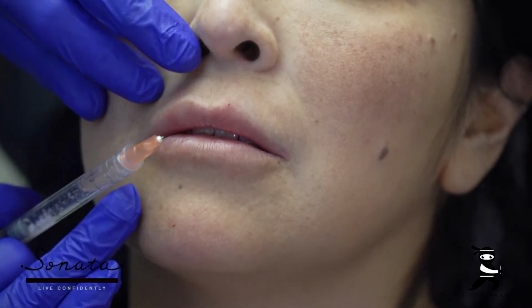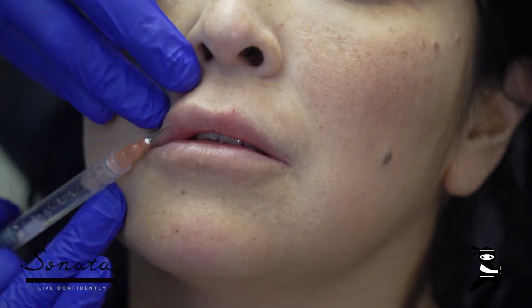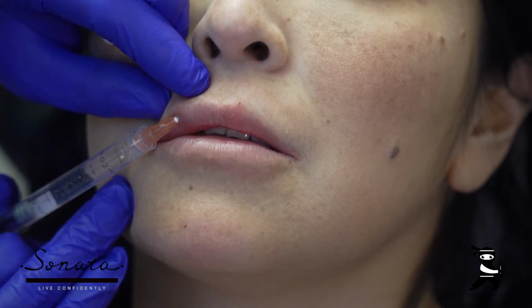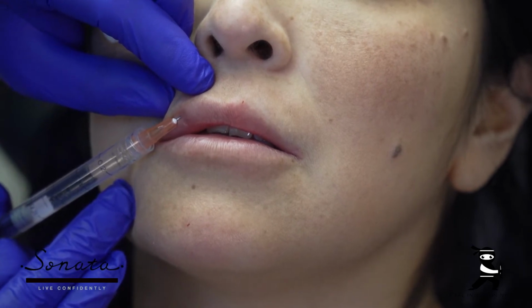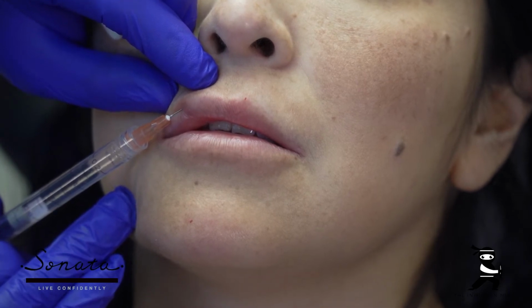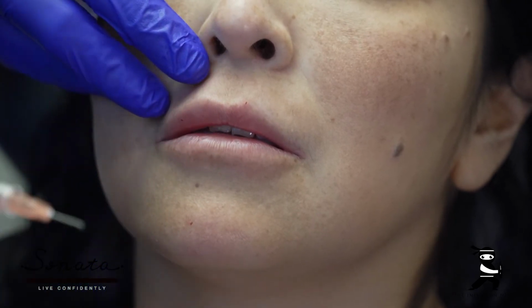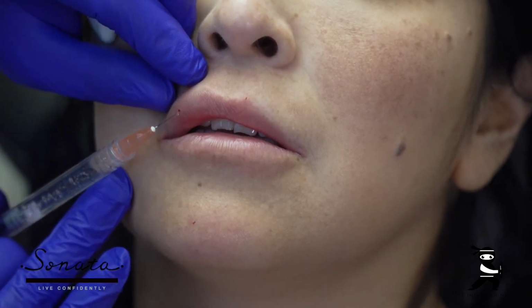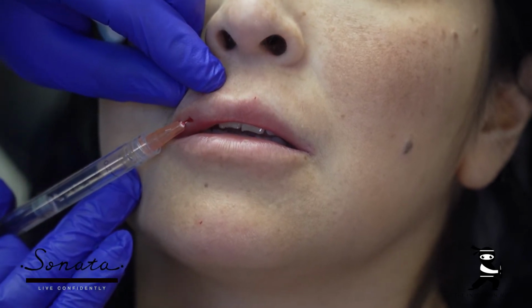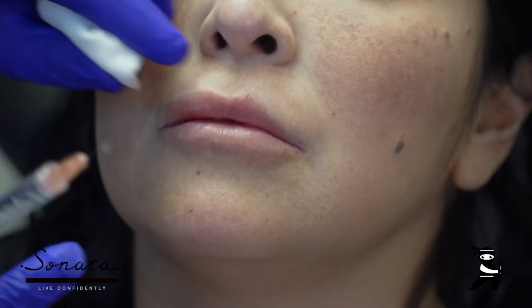This is a great area where we can demonstrate moving that tissue towards the needle, but we start by touching the skin and then rapidly getting the needle under the skin. And then we can slowly inject the product. But the key is to move through the skin quickly. It'll be easier if you have numbing cream, of course. So again, we want to rapidly use the snap technique. It's just a flick of the fingers, not of the whole arm.